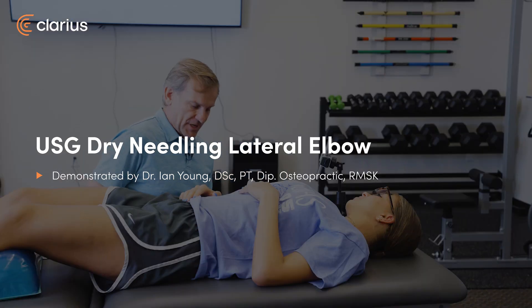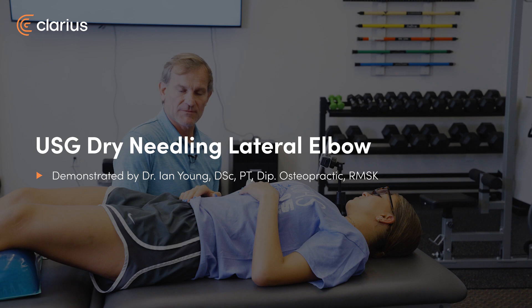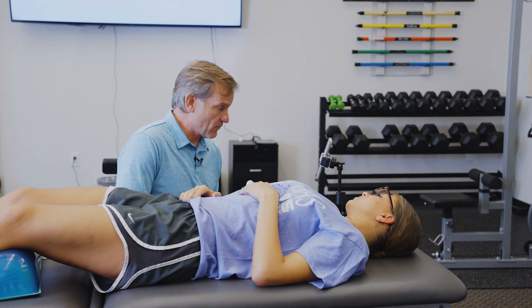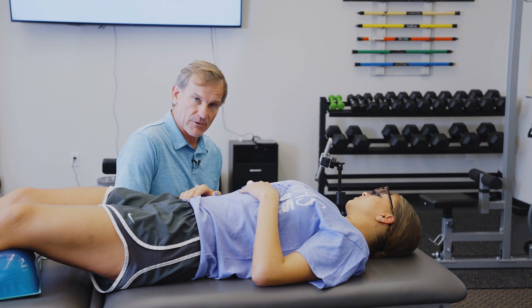Good morning. I'm Dr. Ian Young with Tybee Wellness out of Savannah and the American Academy of Manipulative Therapies Fellowship in Musculoskeletal Ultrasound. I'm here today to perform an ultrasound guided dry needling procedure to the lateral elbow.